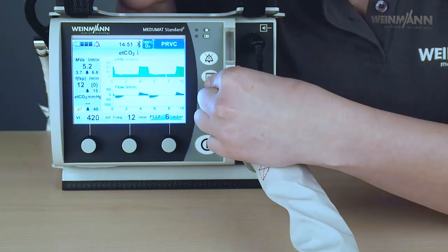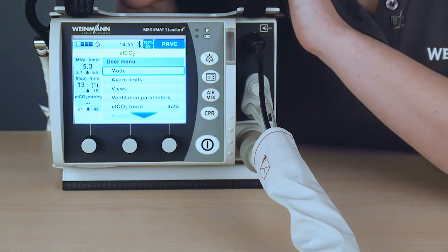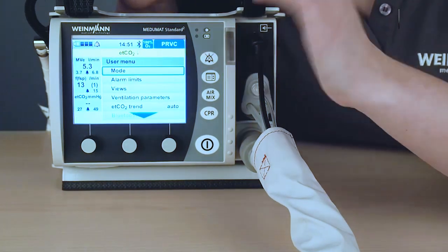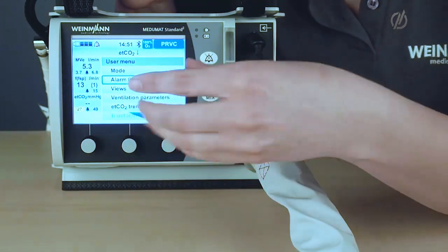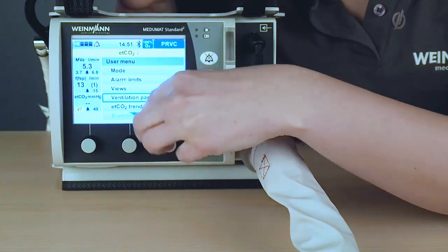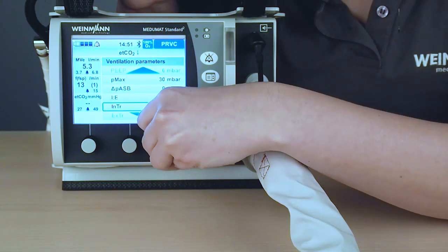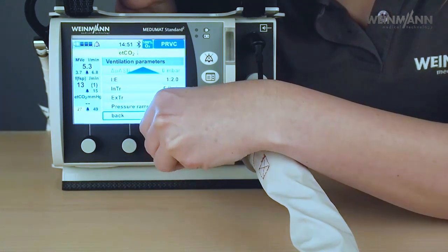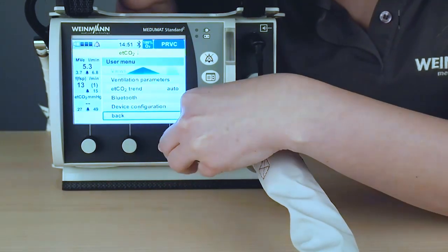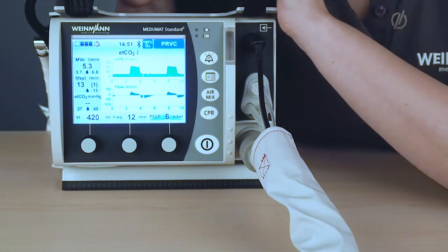Other than that, I have the possibility of a menu. Changing the ventilation mode is possible here. So if I press menu, I have the possibility to change the ventilation modes, also enter alarm limits, and make a bit more specific settings for the patient, for example, trigger and pressure ramp or I/E ratio. So this was a real quick overview of the device.